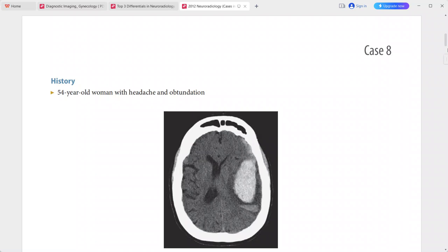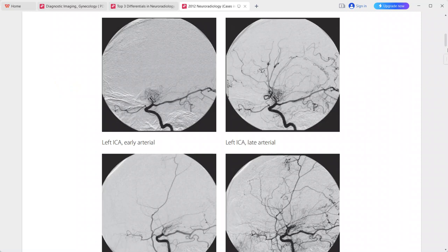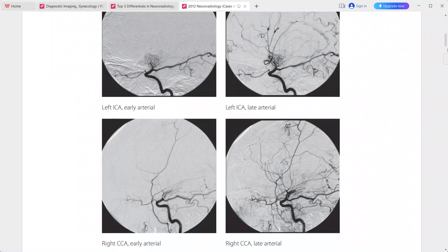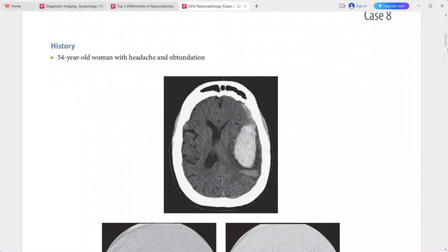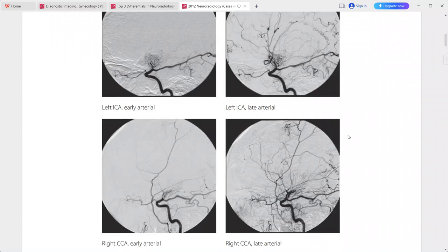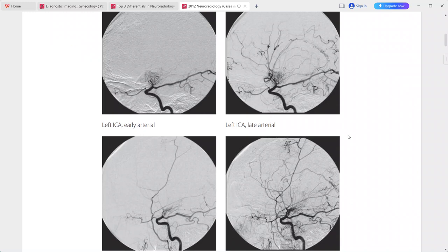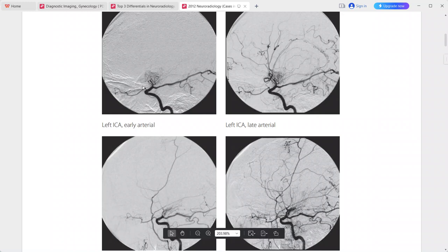Next case: 54-year-old woman with headache and obtundation. Non-contrast CT shows intraparenchymal hemorrhage in the left frontal lobe. Catheter angiography images show severe narrowing of the distal left internal carotid artery, formation of small vessel collaterals giving a 'puff of smoke' appearance.